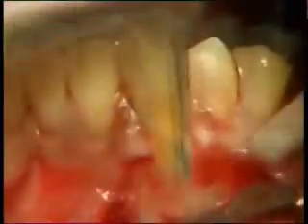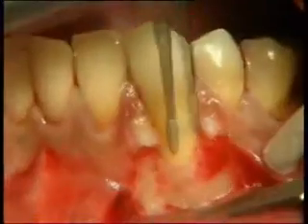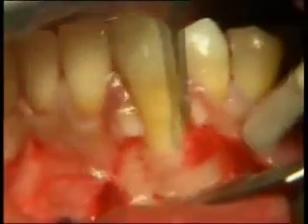Raising the flap, the exposed root is carefully planed with curettes and rotating instruments, with the aim of carrying out the etiological treatment.